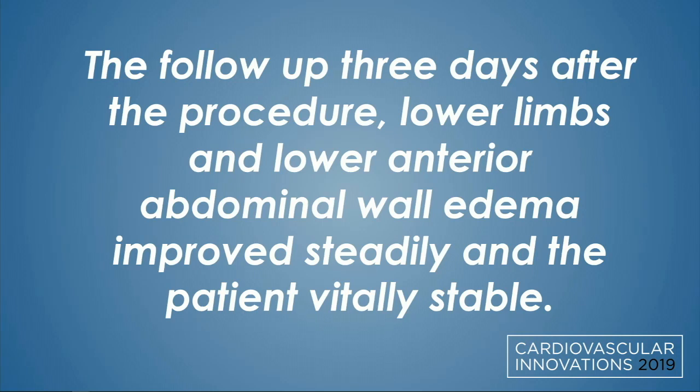In this case the balloon is 16 millimeter, so we are going to stent 16 millimeter or just 1 or 2 above 16, so 18 would be perfect. Yeah, I think in your case, as long as you have a good size, the sizing is not going to matter that much because of the external compression. And this obviously was a palliative procedure, right? Exactly. The patient, unfortunately, had very bad metastatic cancer. The MRI didn't look so good. So this was palliative. It's unlikely this cancer is going to go away.